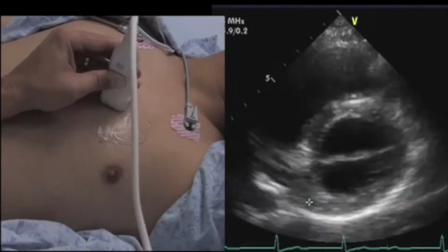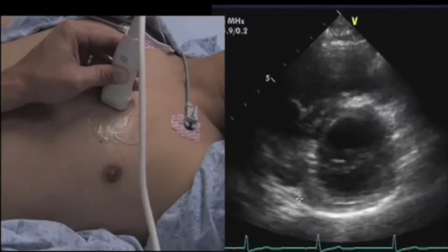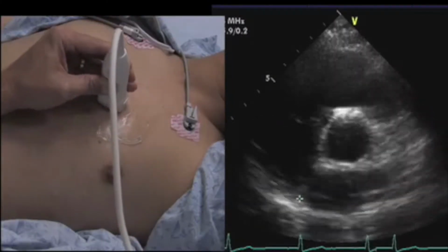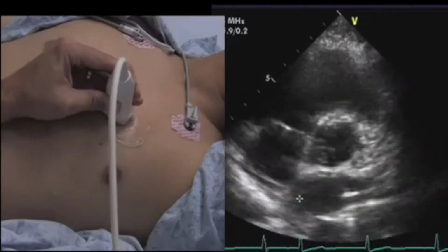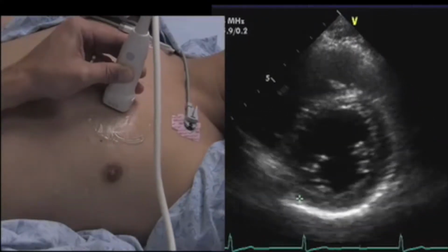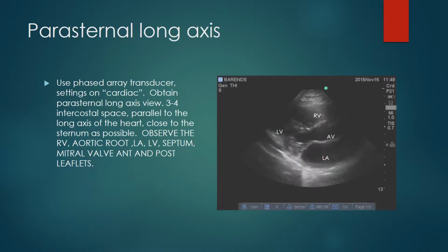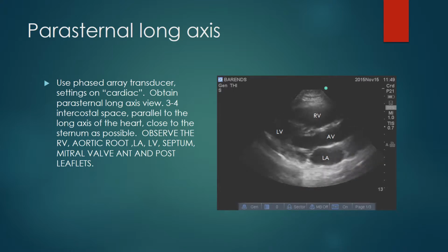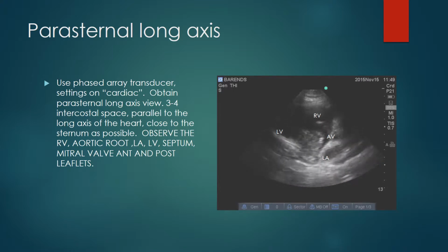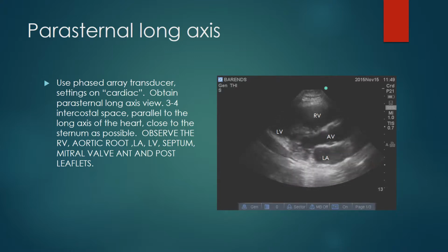The best landmark to choose from is make sure your mitral is squared up or truly perpendicular to the long axis view, and then you'll have the best aortic valve and left ventricle views. This way you will be able to obtain a good parasternal long axis view of the heart. Remember, the ultrasound beam is a thin slice, and you're only looking at a slice of the heart in 2 dimensions.